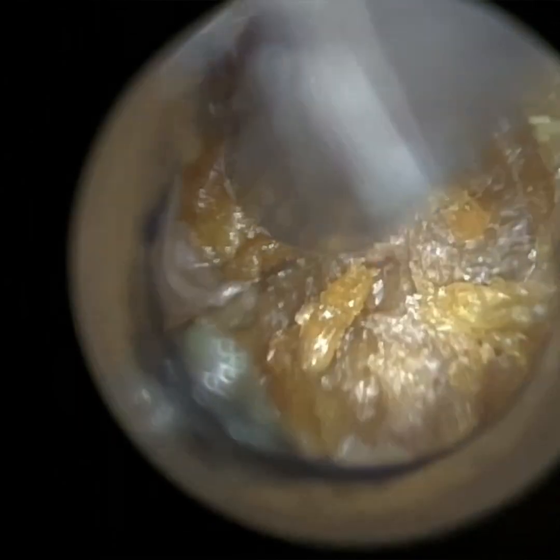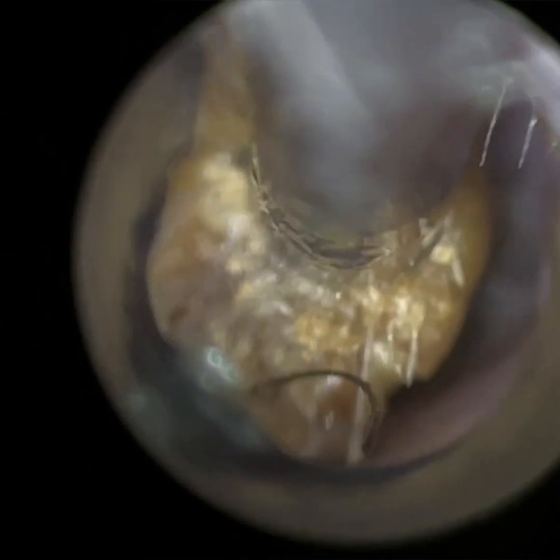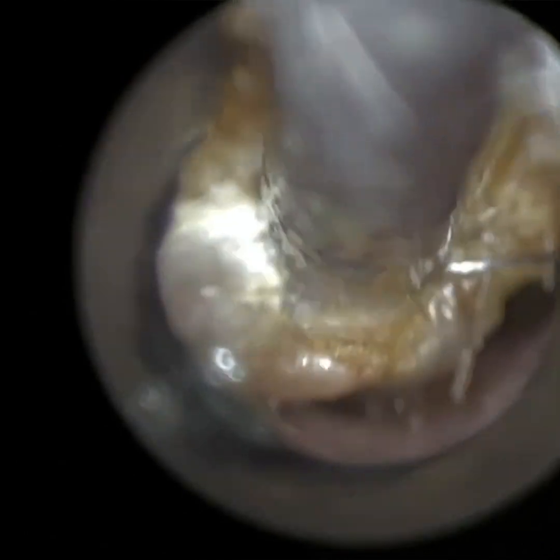That doesn't mean you don't have depth perception. If you've been watching my endoscope videos, you'll realise you obtain depth perception using monocular vision — instead of relying on both eyes, you're using one eye, i.e. a 2D screen, to obtain depth perception. With an operating ENT microscope, you get great magnification but a narrow field of view, partly due to the speculum in the ear funnelling the view.